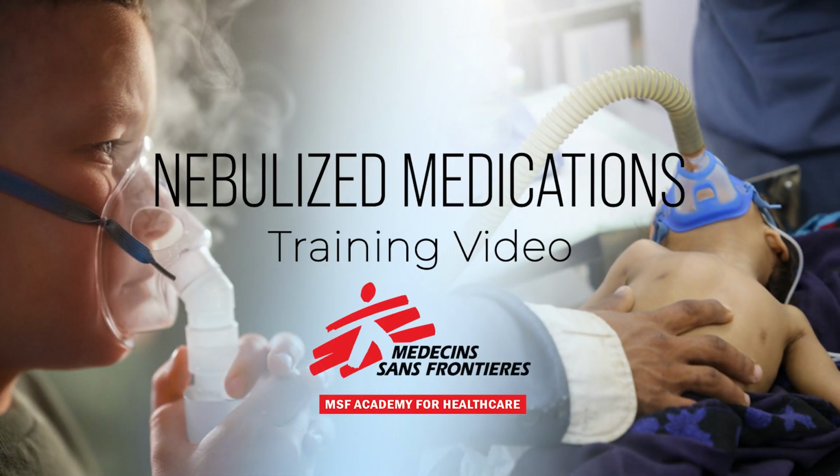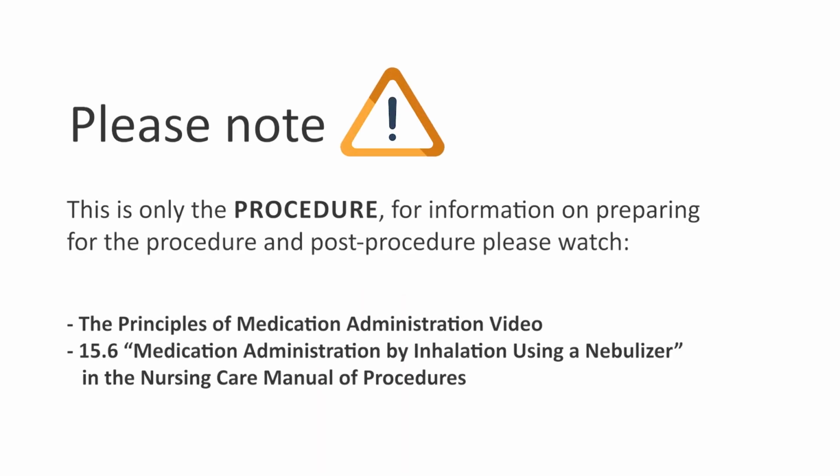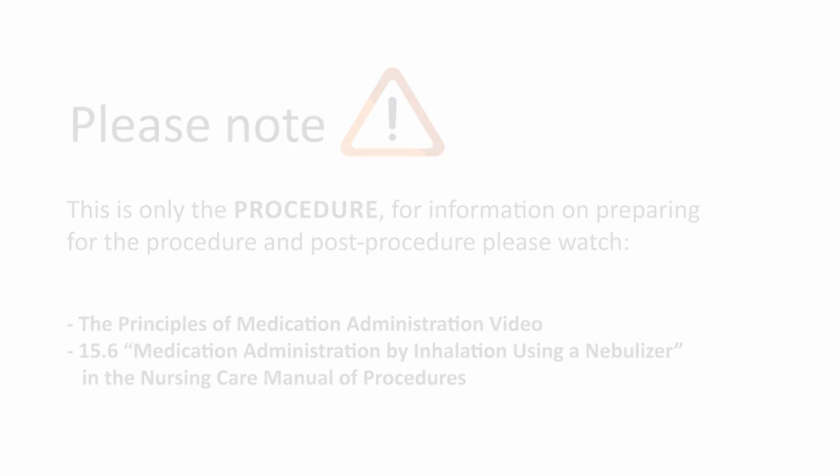Today, we will demonstrate the procedure for administering nebulized medication. Please note, this is only the procedure. For information on preparing for the procedure and post-procedure, please watch the Principles of Medication Administration video and refer to 15.6, Medication Administration by Inhalation using a nebulizer, found in the Nursing Care Manual of Procedures.